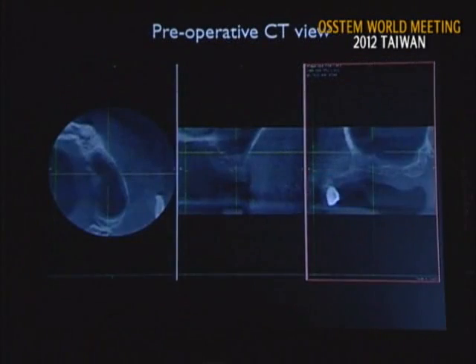In the CT view, you can see a relatively healthy sinus. Although the sinus membrane is slightly thickened, it is within the normal limit, so I don't mind. And the thickness of the lateral wall seems 1 or 1.5 millimeters.